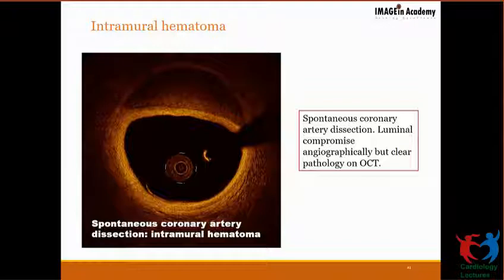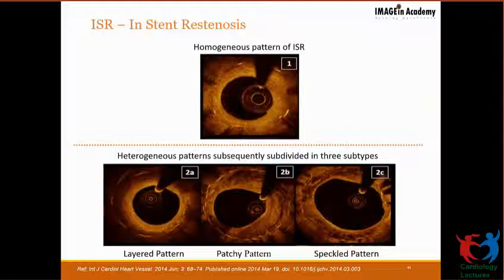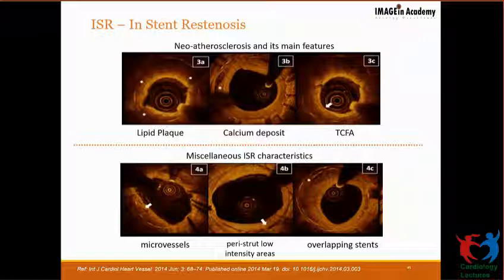Then there is a complete spectrum of ISRs which you get to see. You can have different patterns. You can have a layered pattern. Layered pattern is generally seen in patients with ACS. You have a layer of thrombus and the endothelium grows, and there's a layered appearance of the plaque. You can have a patchy pattern which is more neoatherosclerotic. You can have a speckle pattern where there is both lipid as well as calcific pool. And these are the images of calcific and lipidic plaques.